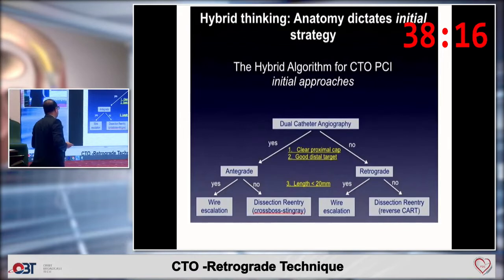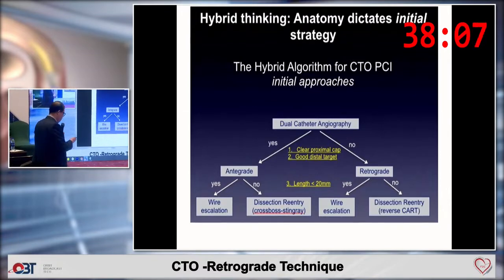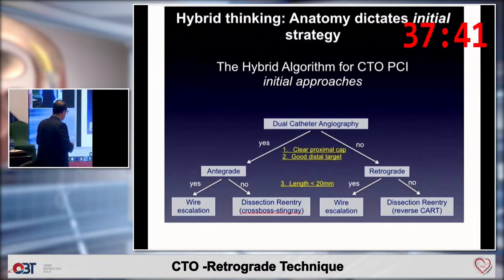So why would you think of retrograde? This was the initial question as well. So it's very important to do a dual catheter angiography. And once you do a dual catheter angiography, if you have an ambiguous proximal cap, you don't have a good distal target, the length of the CTO is greater than 20, so there are very few chances that you will be able to succeed antegradely. So you will have to proceed via the retrograde approach. So the retrograde approach can be through wire escalation, as we did, or through reverse CART, which is subintimal dissection and re-entry.